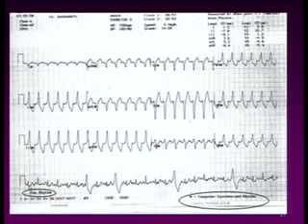This could be artifact. Another incident is when you have a computer synthesized rhythm. Now if you see such an ECG, at first you will start thinking there is a broad complex tachycardia. You wonder what is happening, but if you see the rhythm strip at the base, what is happening? There are isolated PVCs which are coming, and what has happened? There is a computer synthesized rhythm which is generating and giving an impulse, an image that you have got a broad complex tachycardia. So it's not broad complex tachycardia. If you see the raw ECG, you can diagnose that these are not that.